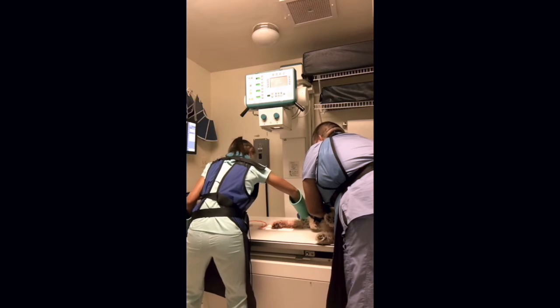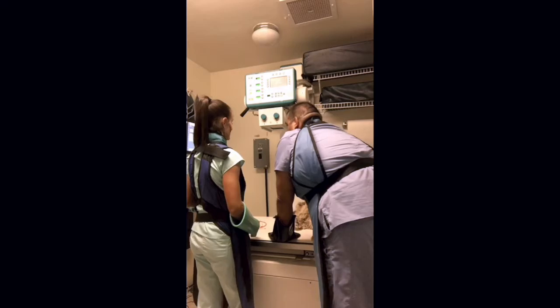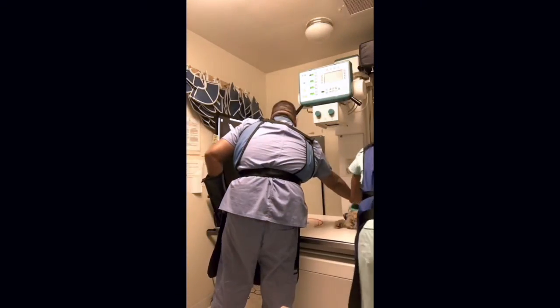If a patient was in dorsal recumbency for the contralateral image of the proximal limb, such as the scapula, the shoulder, or the humerus, it's titled as a caudocranial view when the thorax is in a VD position.